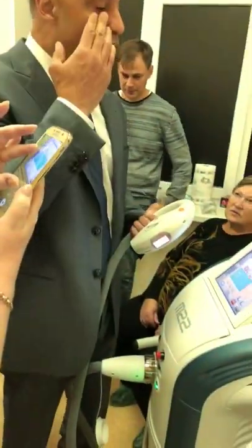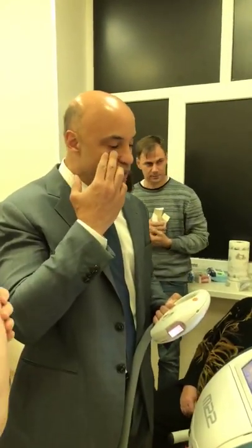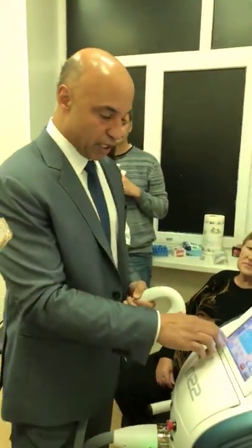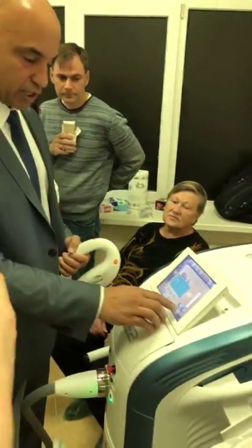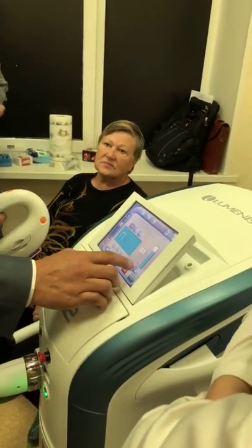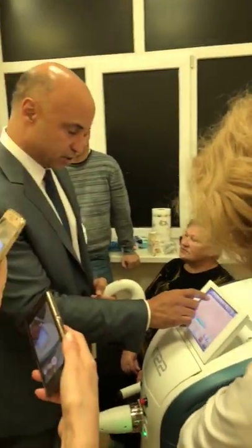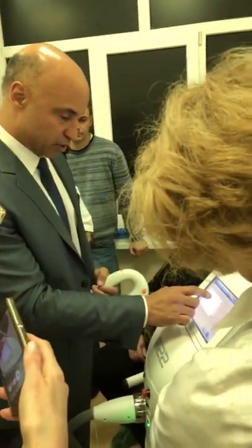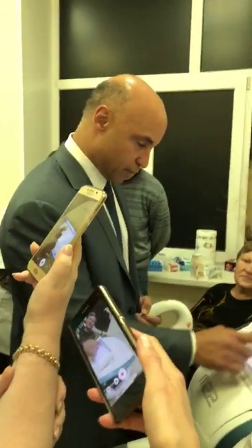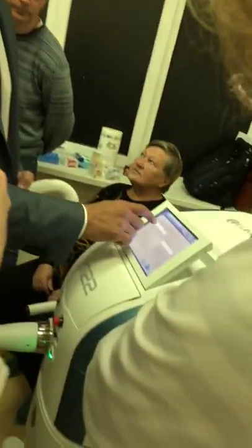So this is why we can actually get really close to the lid margin, because we're not going to burn that thin skin around the lid margin. All right, so then the chiller is on. Where you guys are going to be doing treatments is anywhere from 10 joules, and the most that you're going to give somebody. Let's see if my parameters are here. Okay, my parameters are not. So we've got to add my parameters in. So let's go here.